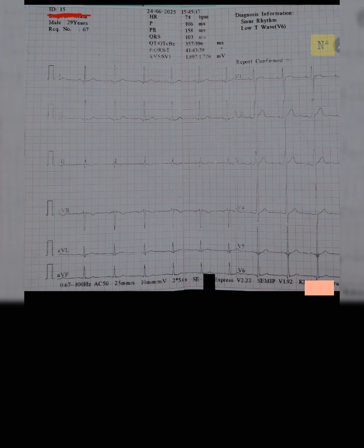Now in certain ECG rhythms you can see the curves are inverted. Sometimes in a lead the curves show a positive deflection, and in certain leads you can see a negative deflection of the curves. Why there is a different morphology of the curve is because of the placement of the heart and the conduction pathway. We know the heart is placed in a left-sided area having the conduction pacemaker point as your sinoatrial node.